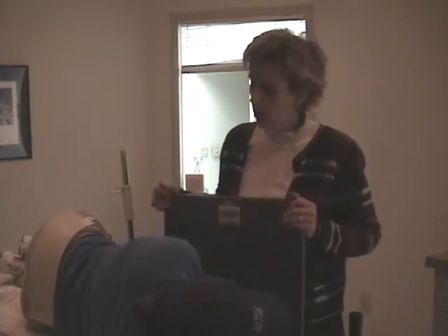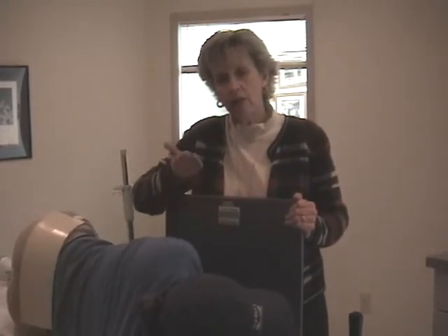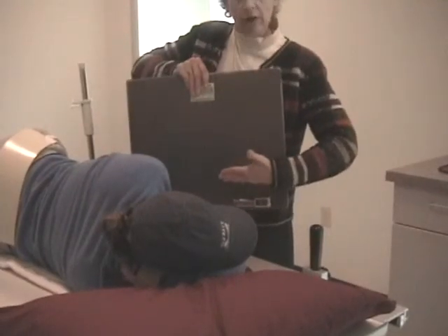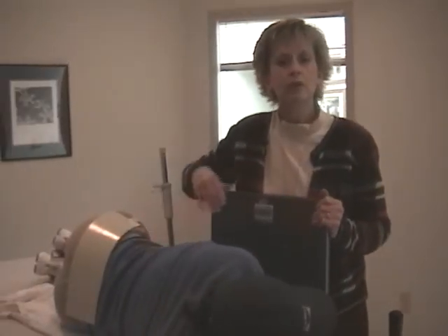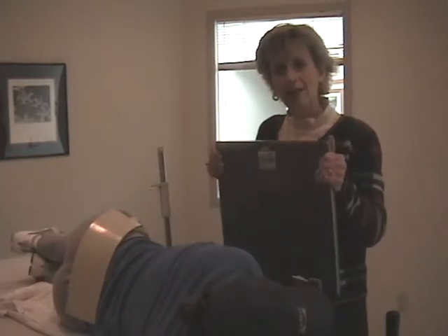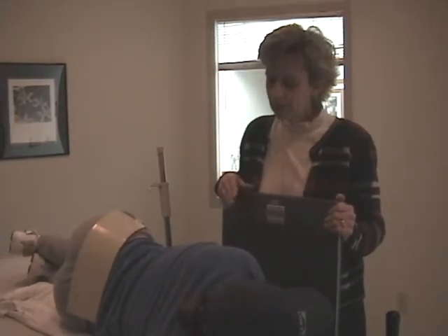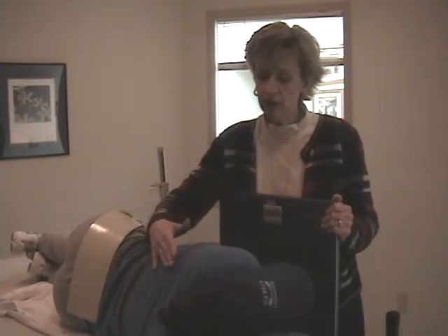costophrenic angle. The reason the patient's built up onto a sponge is to elevate the downside so it's higher than the cassette edge to make sure you get all anatomy on there. So when you're doing a decubitus chest, you must build the patient up onto a sponge. Therefore, make sure the cassette is not up on the pad. The cassette goes down flat on the table, and the patient is built up a ways on the pad. With her chest in this position, she's in a right lateral position.